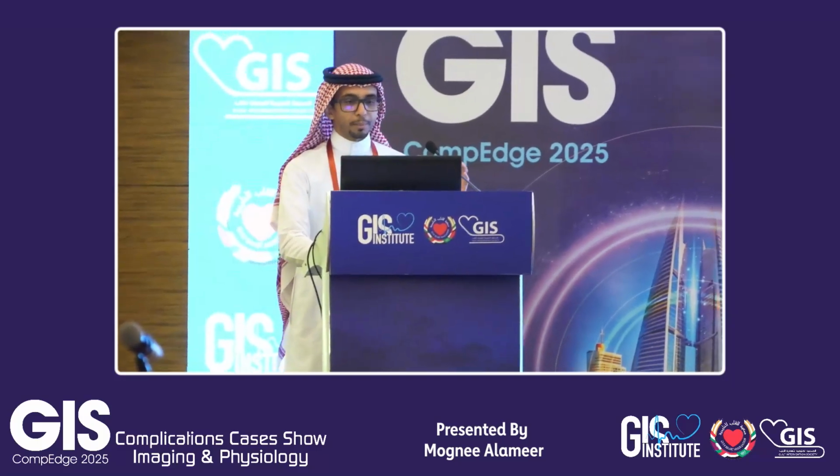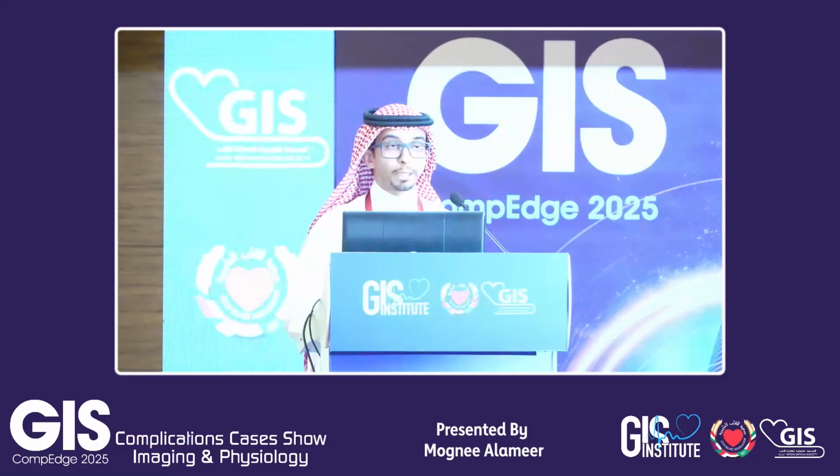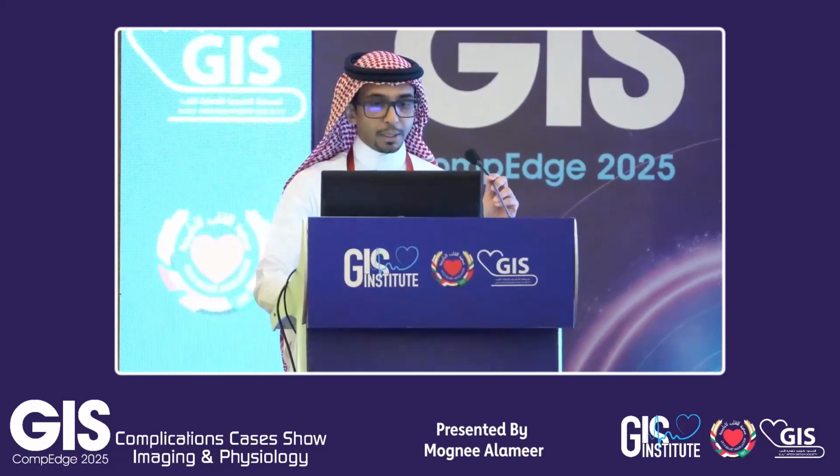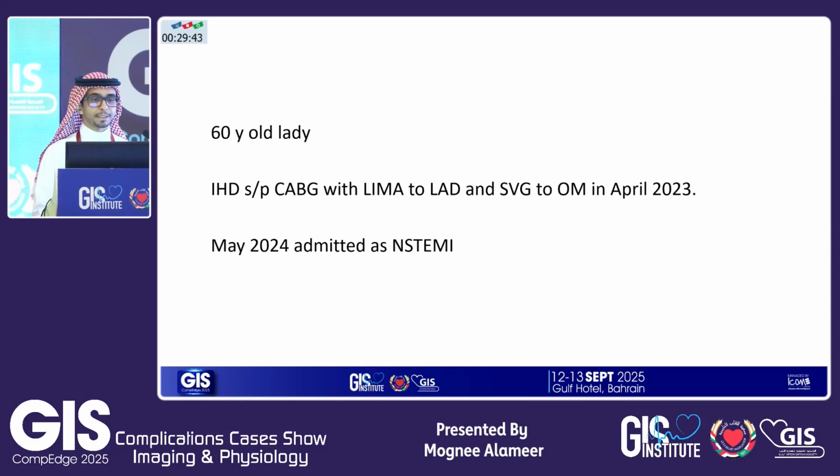Okay, so my presentation is about intravascular imaging in special situations. I have no disclosure. I'll present two cases.